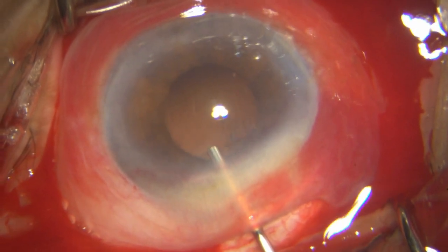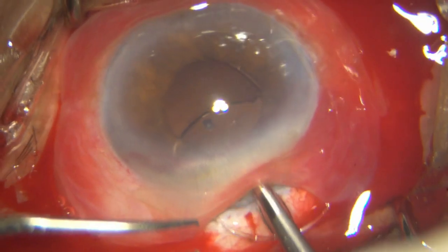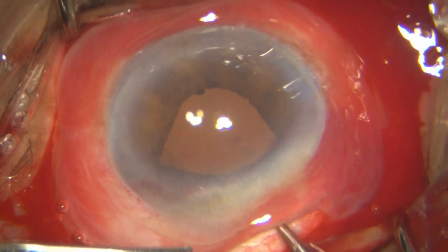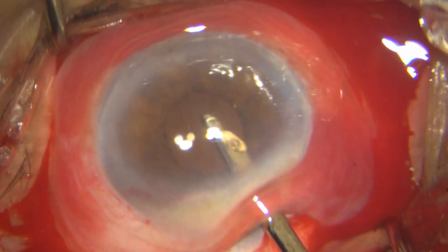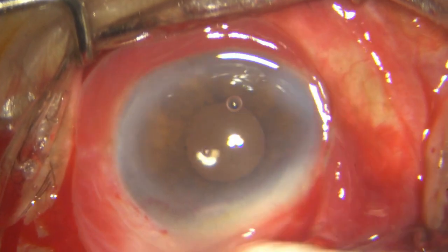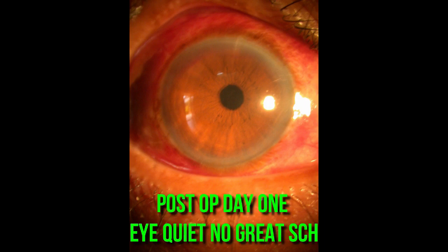put in some HPMC, and I am putting in my single piece rigid PMMA IOL directly into the bag. And then I aspirate all the HPMC, and I'm just checking, cleaning up. There's a lot of blood, but you just wait and see. It looks bad, and look at the post-op. It's beautiful, it's crystal clear, and there is hardly any SCH.